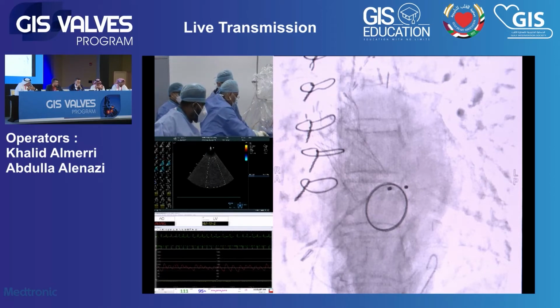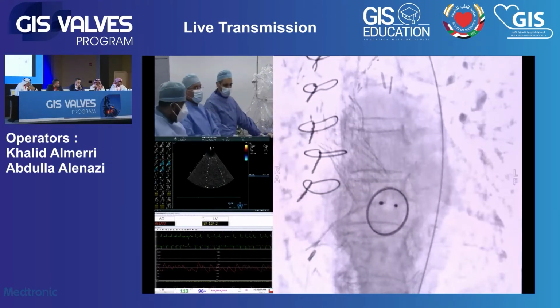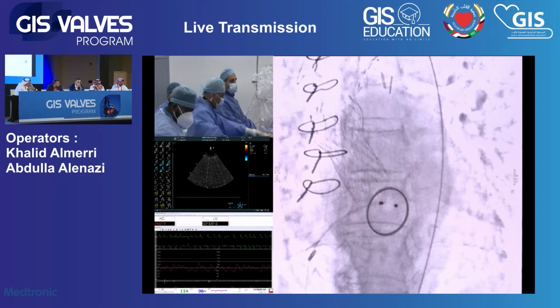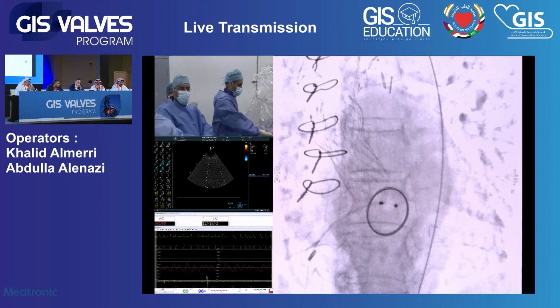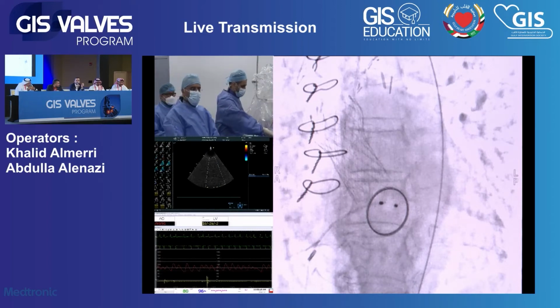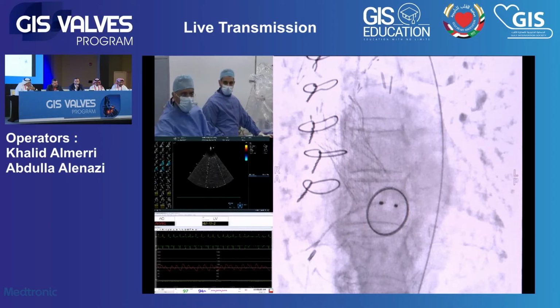Like he said, it's a low gradient, and we know from the self-expandable valves, just give it a little time, and even the mild, maybe trace, regurgitation disappears. And this is the most advanced type of Medtronic valve, with a nice seal and nice delivery system. Yeah, I will leave it at this stage, and we are happy. Albert? Yeah, I agree entirely. I don't think it's indicated in this case. However, in bicuspid valves with a high calcium score, there are some cases where you need to post-dilate, particularly if we're going to start implanting in young patients, not specifically this one.